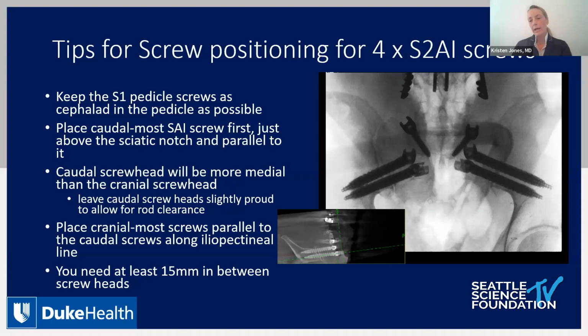And as far as rod capture rates, you absolutely can line these up to all be in one rod. I typically am using the 4 points of pelvic fixation when I have more than one rod on each side. So in order to accommodate 2 rods on each side, I find it helpful to leave the caudal implant slightly prouder and the head actually just purely medialized. And I'll do that with a closed screw head, so I'm not toggling that around to engage the rod.